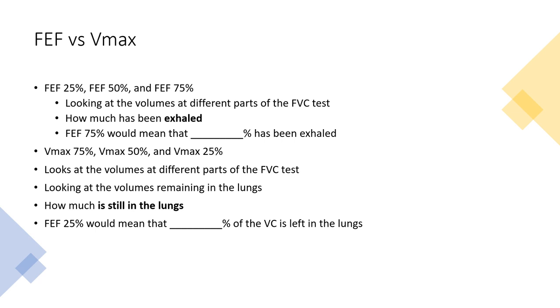So we're going to get a little deep here. If you need to take a break, take a break. All right, so this looks at the volumes at different parts of the FVC test. So this looks at how much has been exhaled. So FEF 75% would mean that 75% has been exhaled. There we go.